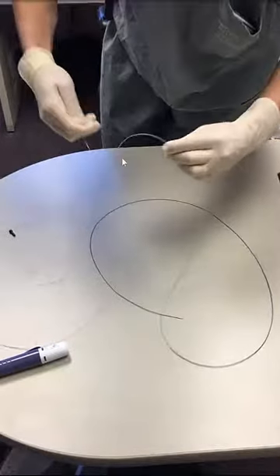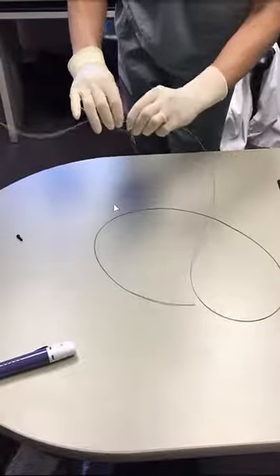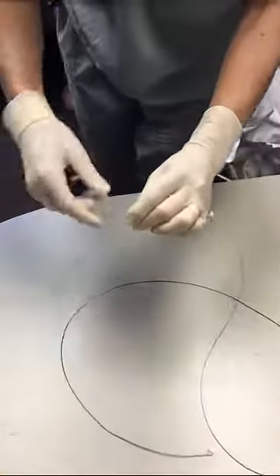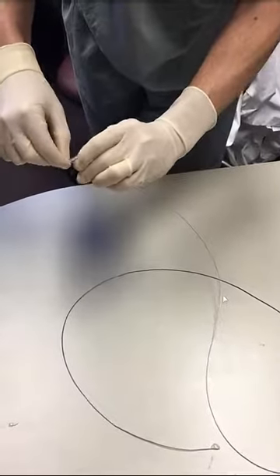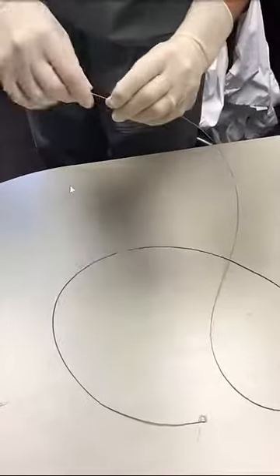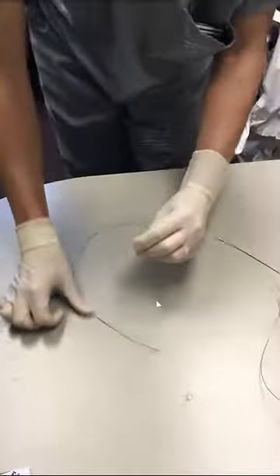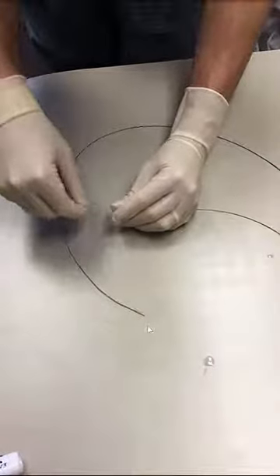After doing that, the back end of the coil is advanced into the microcatheter by a second person who is sitting on the back. And then after enough portion of the coil has been inserted into the microcatheter, the next step is to remove the plastic sleeve and then continue advancing the coil over the wire. So the plastic sleeve is removed and now the coil is advanced towards the tip of the microcatheter.